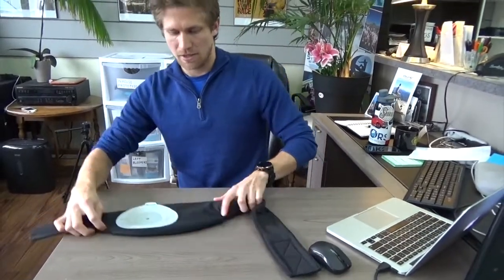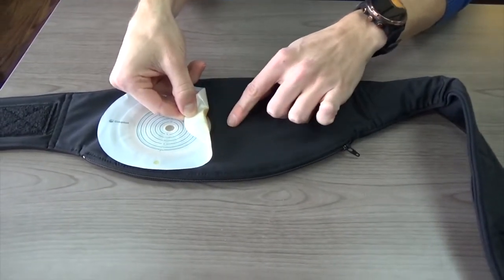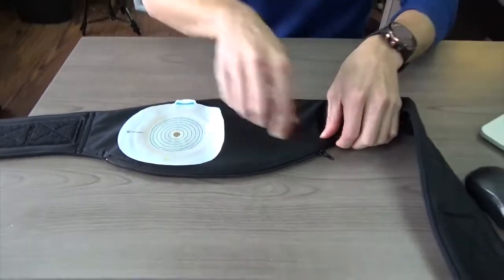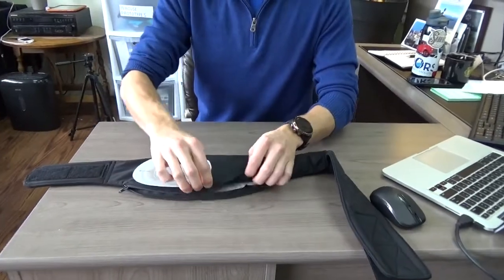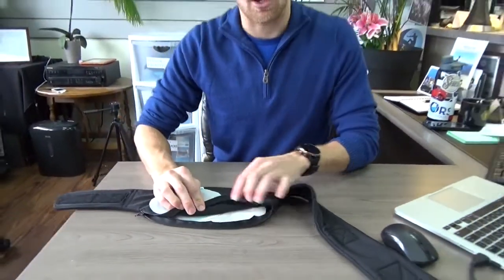I'm going to show you what the finished product looks like when it's inside the belt once you've done your measurement. You'll see when you fold this up that the extra piece is inside the belt, and when I unzip it you can see the bag is laying nice and flat in there — this is where it's connected off towards the side.